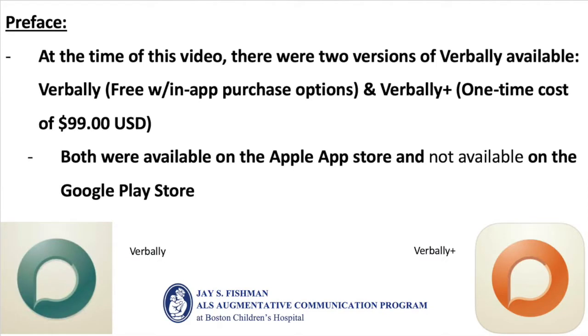In addition, at the time of this video, there were two versions of Verbally available: Verbally free with in-app purchase options and Verbally Plus with a one-time cost of $99. Both were available on the Apple App Store and not available on the Google Play Store.